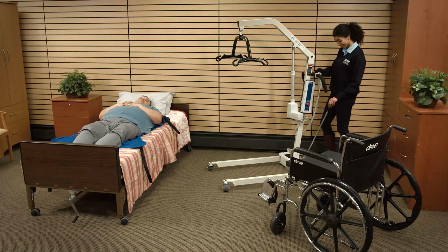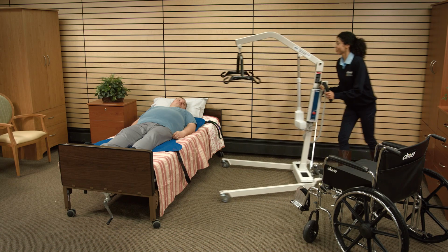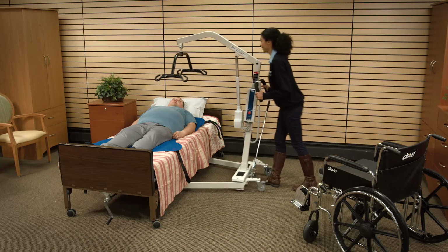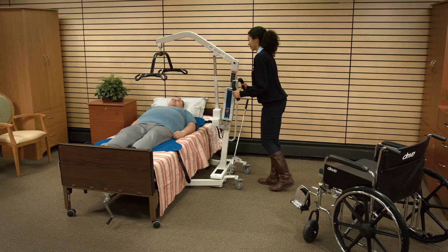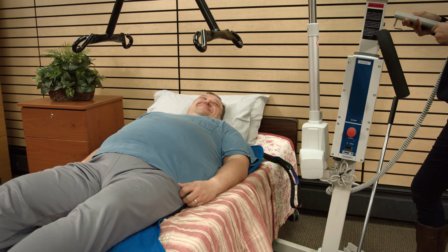Spread the base legs of the lift to the widest possible position. Next, make sure that the base of the lifter is under the bed. Press the down button on the control handset to lower the lift.